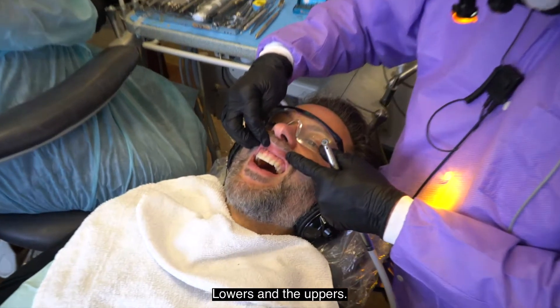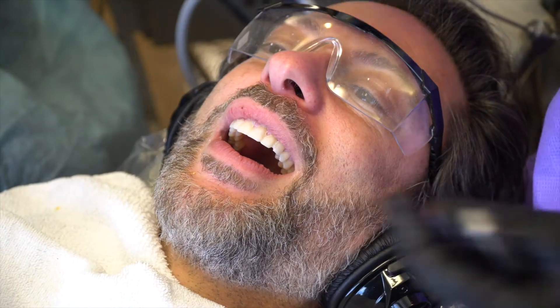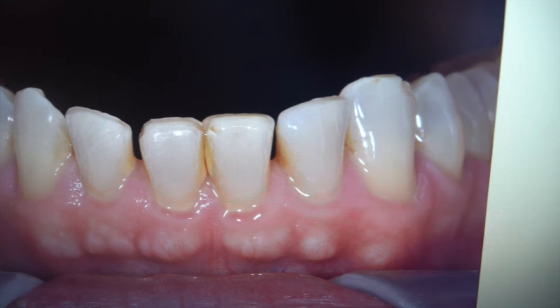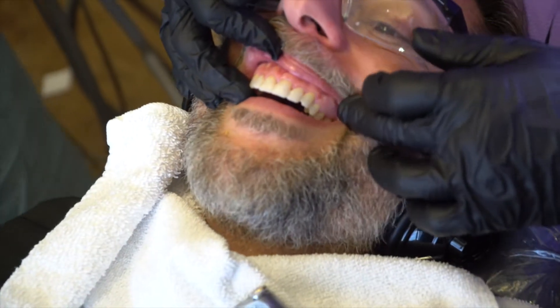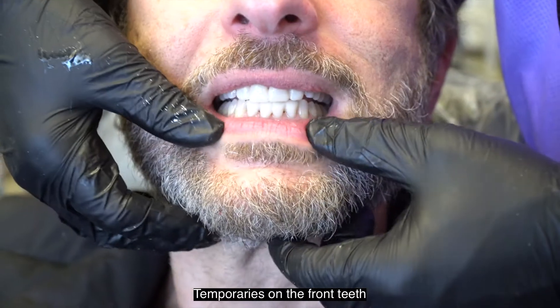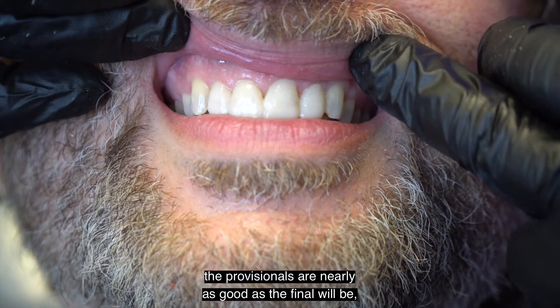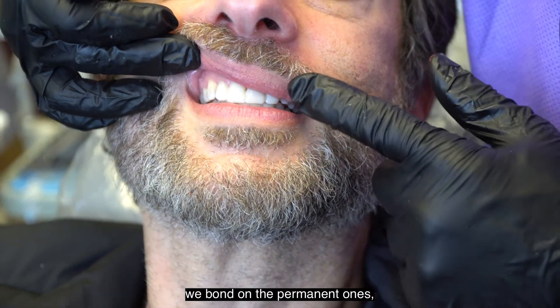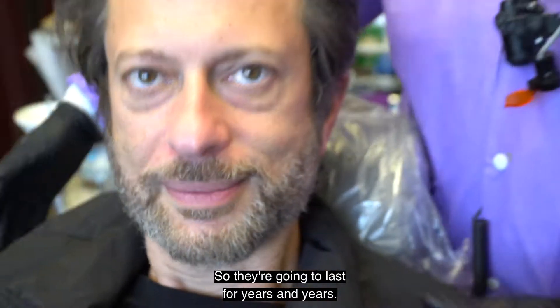We've placed provisionals on the lowers and the uppers, and we're going to now trim and polish off the excess. He's got them on the front teeth on the top and on the bottom. It's really important that the provisionals are nearly as good as the final will be so that the gums are very healthy. When we go to bond on the permanent ones, the gums need to be healthy so we get the best possible bond, and they're going to last for years and years.